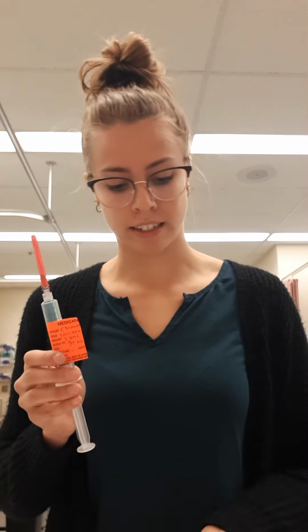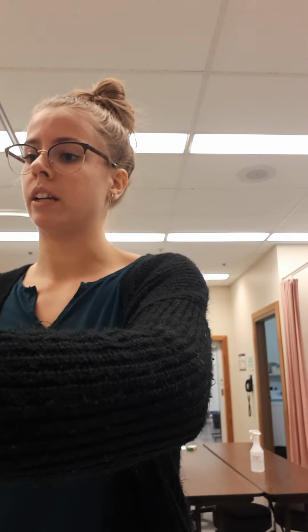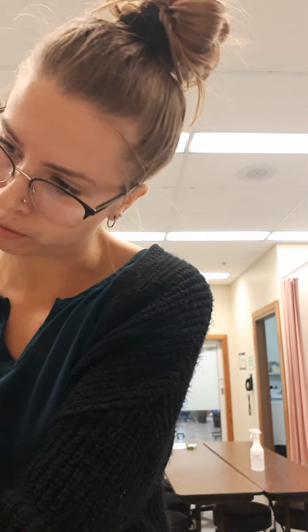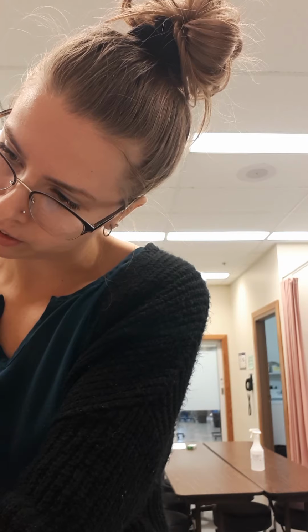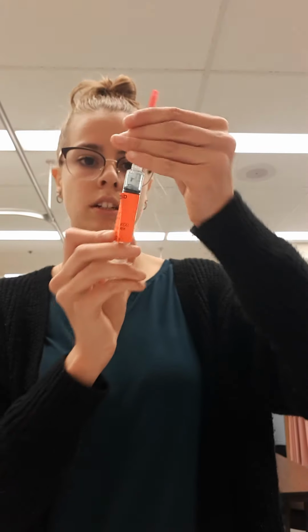Carried away there, so before I go to the bedside, I need to do my wasting. So as per my math, which was checked by an RN, I am going to be wasting 7.5 mils, and I'm going to do that into the sharps bin. So I'm going to waste my 7.5, and then as I get closer to the 2.5 mil mark, I'm going to go a little slower to make sure I'm accurate with the medication and the contents of my syringe. So there, I have 2.5 mils in my syringe now.